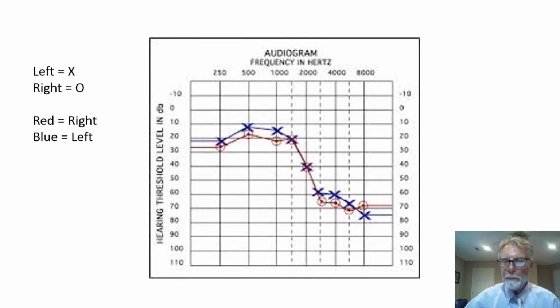If our audiogram were plotted right across this 0 line, that would be absolutely perfect hearing, right? You might not be able to get that in your environment, and that will be okay, unless your environment is way too noisy to test. Then everybody would fail. But anyway, they determine the threshold, and you would mark the threshold on the graph.